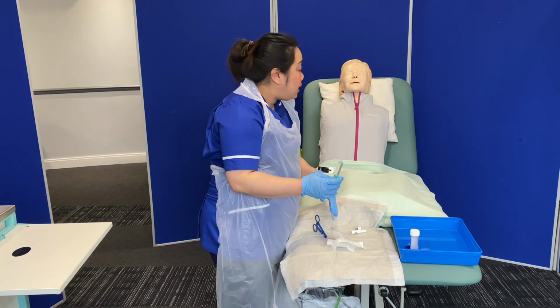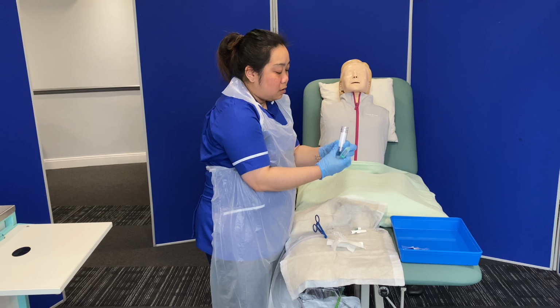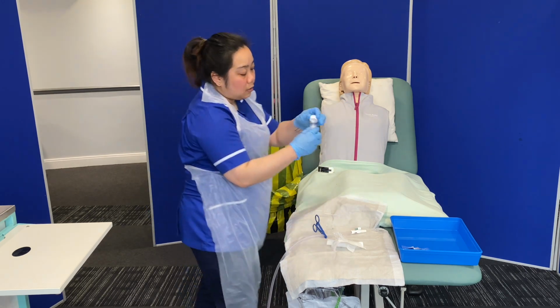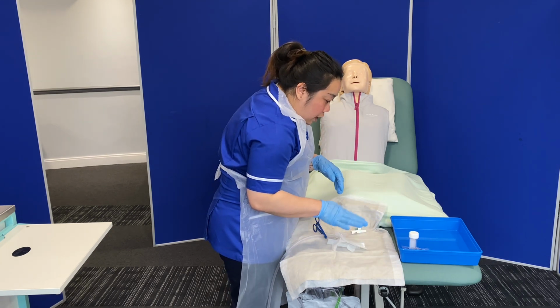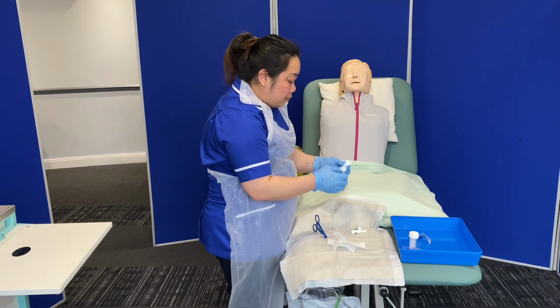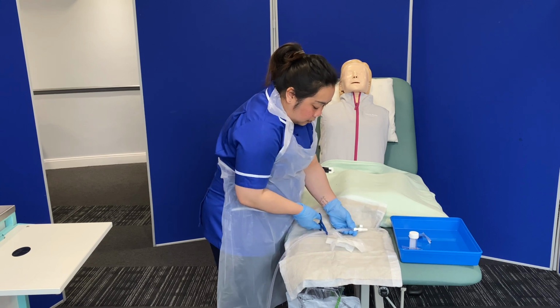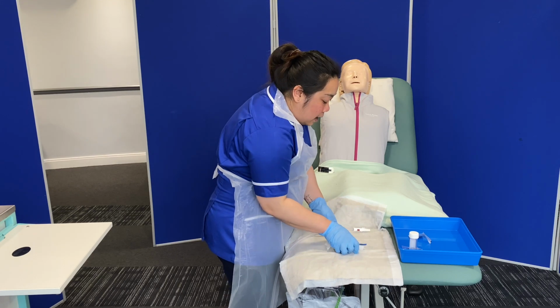So I'm going to immediately put it in the specimen bottle that I have here. So that is 10 mils going straight into the specimen bottle. And I will immediately discard the syringe and close that tightly, right? So now that that's done, I will use my other Clinell wipe so I can clean the sampling port again. 1, 2, 3, 4, 5, 6, 7, 8, up to 30. Right? I have removed the clamp now, Lindsay. Does that feel okay? Yes.